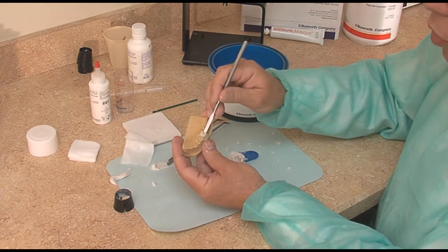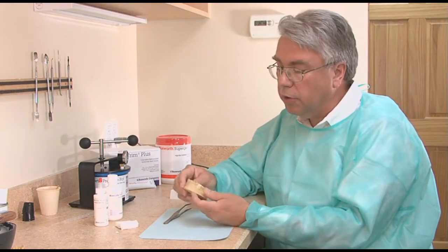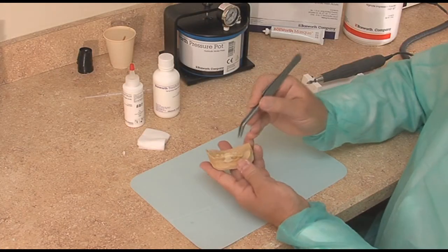I will not try to remove it at this time yet because it's still a little too rubbery. Okay, several minutes have passed and the material is now quite rubbery.